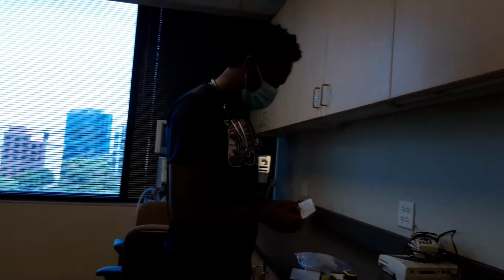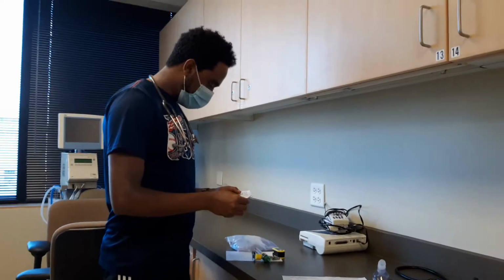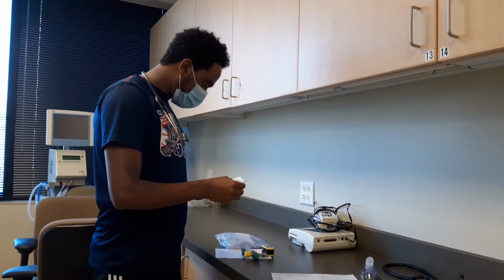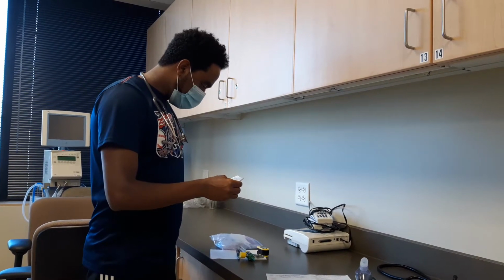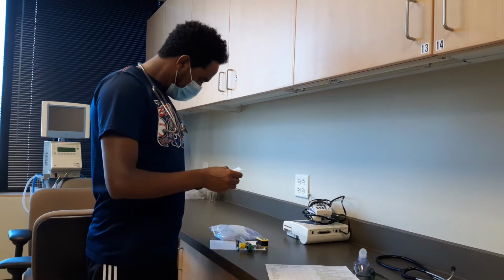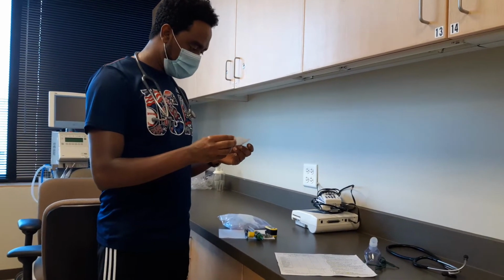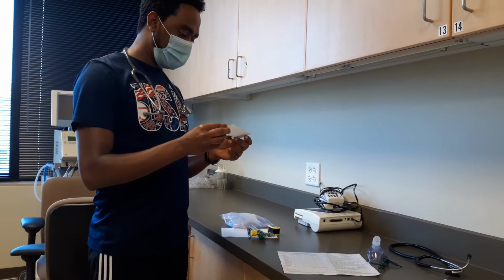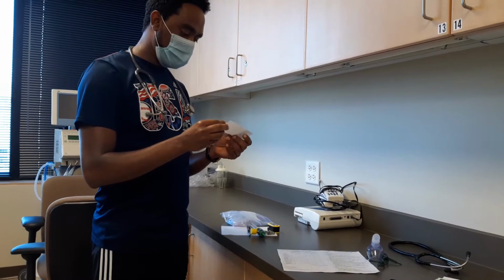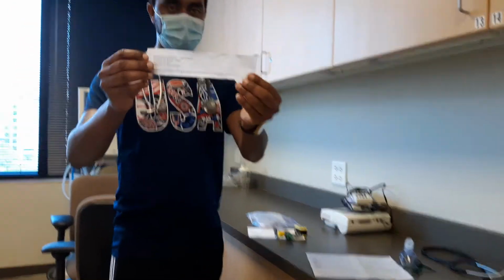I'm a student respiratory care tech, and the doctor orders for my patient Charles Ashant, date of birth February 2nd, 1970. Here is the physician's order to administer 2.5 milligrams of albuterol and 500 micrograms of Atrovent via nebulizer every 4 hours.